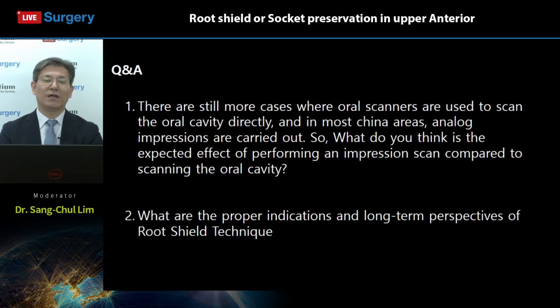Anyway, an intact tooth fragment is an essential and necessary part to maintain and proceed with the socket shield technique, right? It is inexpensive also, and good for preserving and well maintaining the labial bone, even though very thin layers, and a good option for anterior aesthetic immediate implantation.